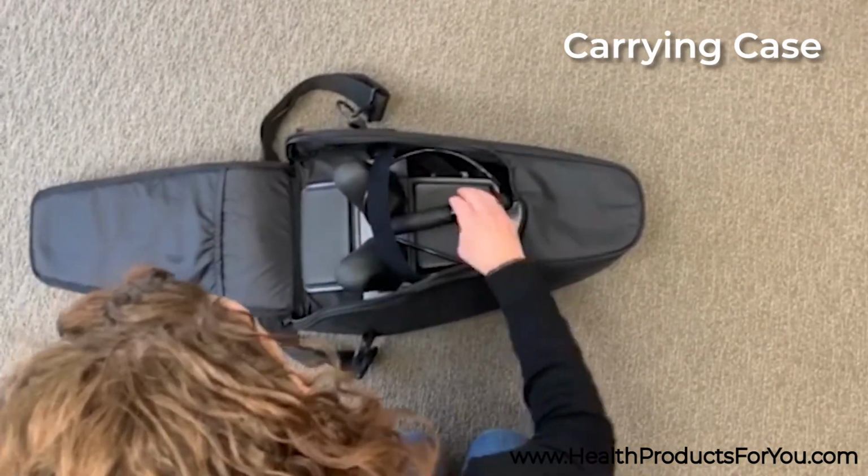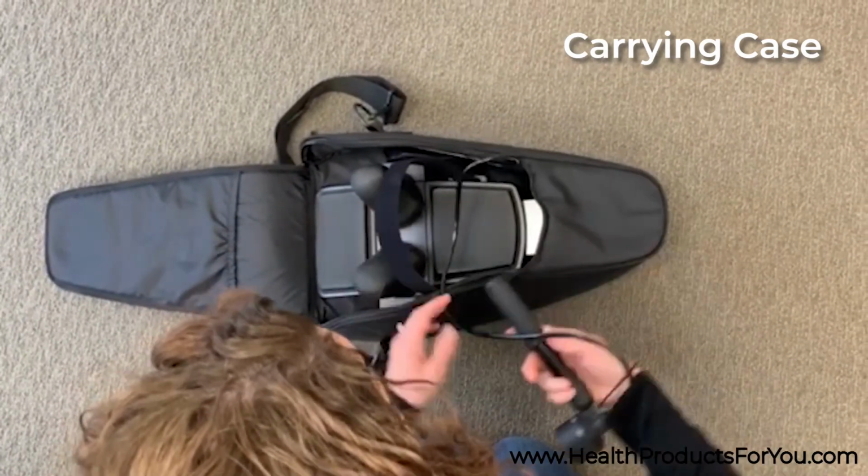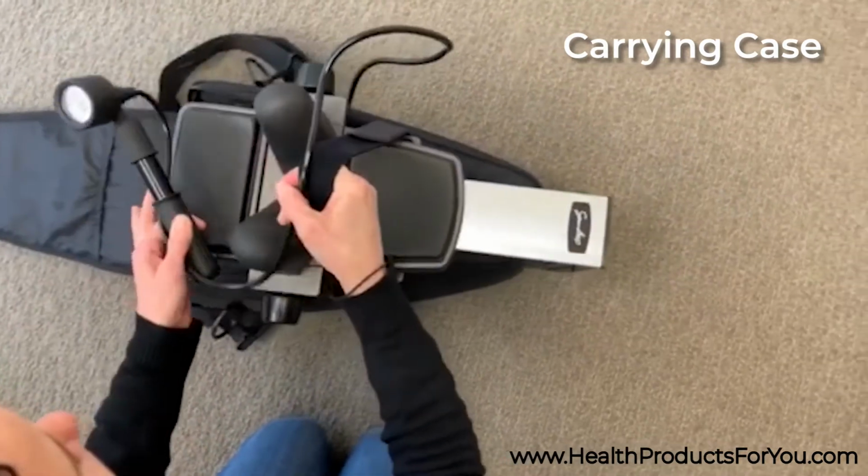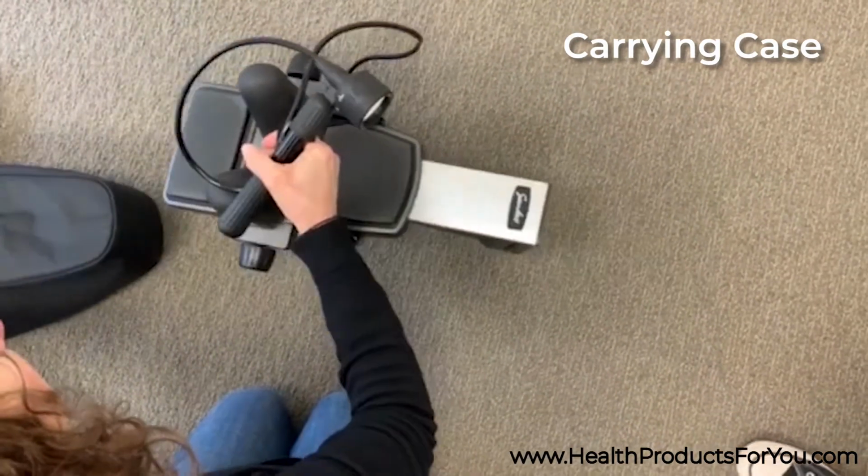To use this device, first set the traction angle prescribed by your healthcare provider. Once you set the designated angle, place the device on a carpeted floor or another firm surface.